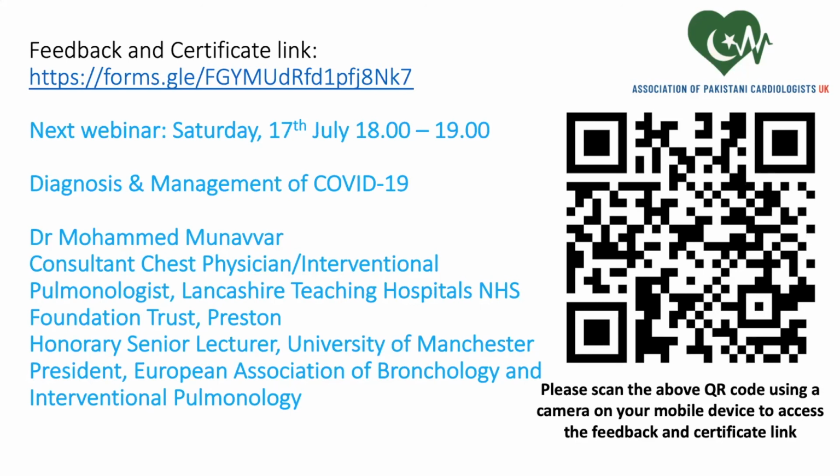Can I also mention one important development, which is hopefully coming within about 12 months or maybe longer: a single catheter which will have both OCT and IVUS transducers, so you do not have to buy both modalities of imaging. That type of OCT or OFDI is going to be a non-blood clearing method, which means you push the catheter, and wherever you want to switch on to do IVUS, you will do IVUS, and wherever you want to do OCT, you will do OCT.